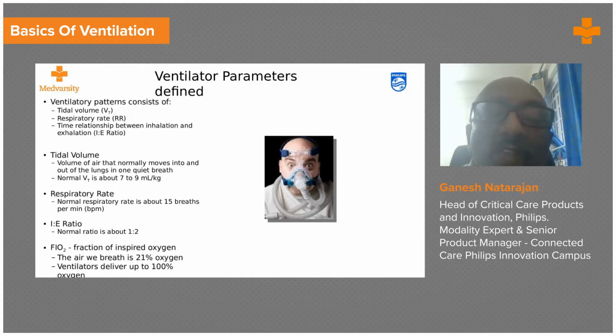But there are various ways that you set the tidal volume. Various disease patterns have different volumes that you can set. The ARDS net protocol says 6 to 8 ml per kg body weight. Another group for non-ARDS patient is also 9 to 10 ml per kg body weight.